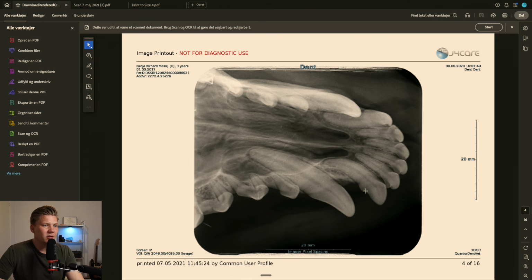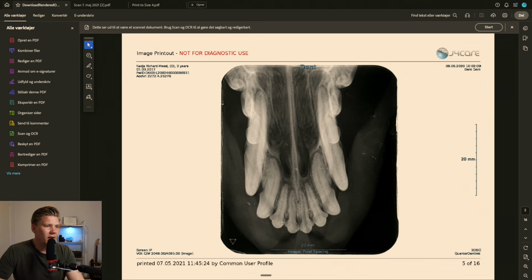And here, the incisor, this looks okay right here. And you can see that actually there's not a lot of bone loss on the x-ray. So with this bleeding that we saw before, we're gonna have to take a closer look when we do the cleaning and the curettage, so we root plane, scrape out the pockets, see what's in there, see how deep they are, and so on.